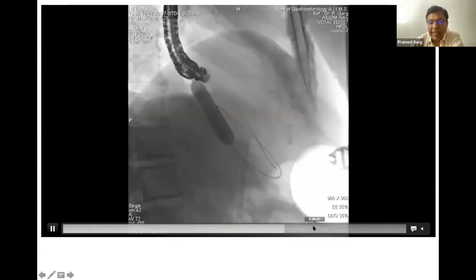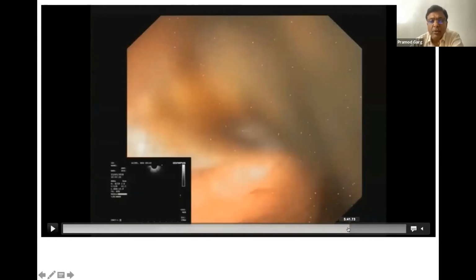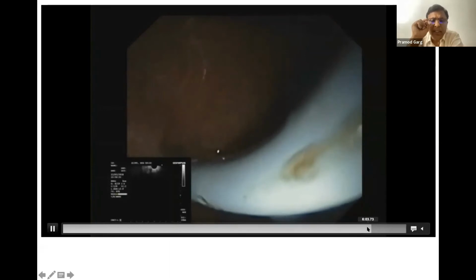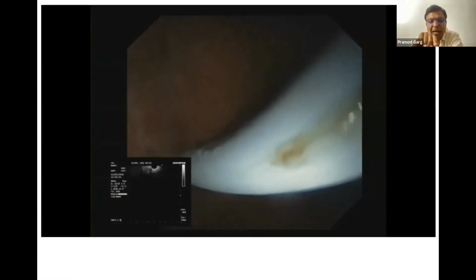Now, after you have dilated, you can place a stent introducer set, and you want to place the stent. Here I want the attention of the residents. You see the stent is being placed. This is the first black mark which has gone in.